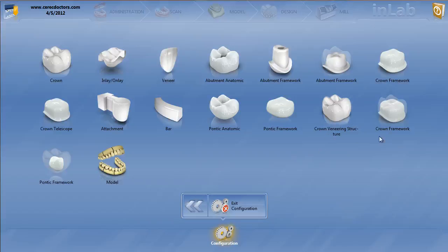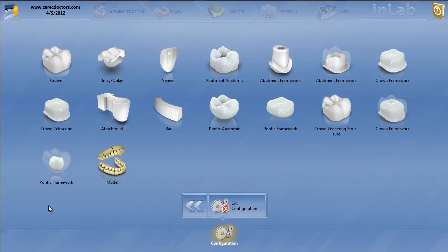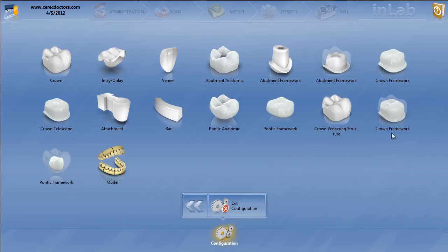Now you'll notice that specifically on the crown framework and pontic framework, you'll see these frameworks with a transparent full-contoured tooth over the top. These are the framework parameters used when using multilayer function, meaning when you design a single unit or a bridge in multilayer mode like CAD-ON or VETA rapid layer. When you reduce that full contour into the framework structure, these are the parameters for those frameworks.